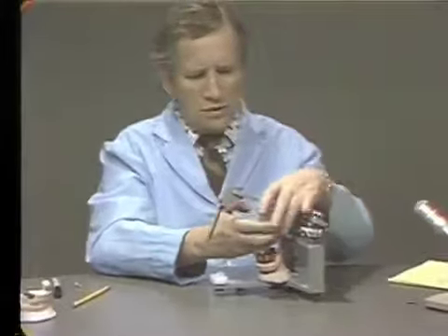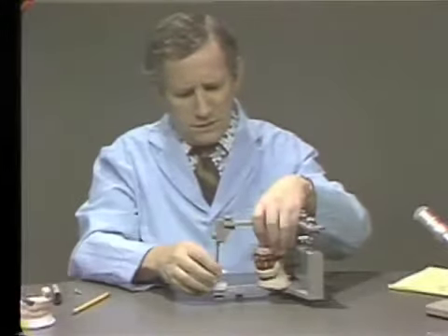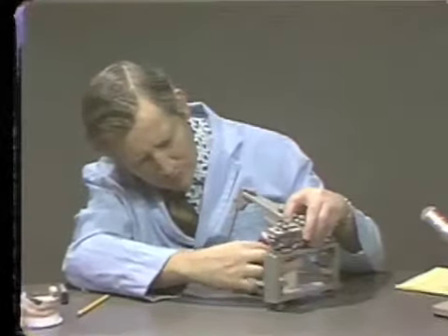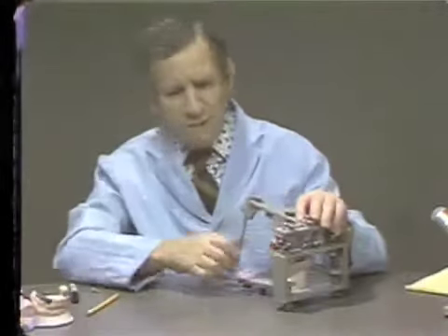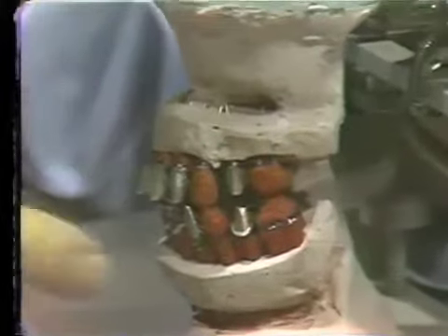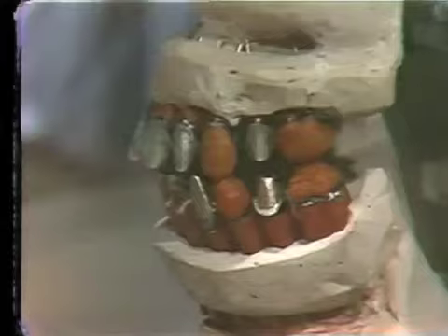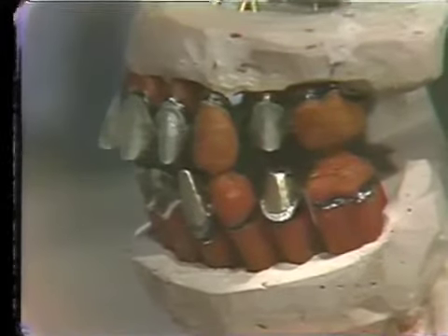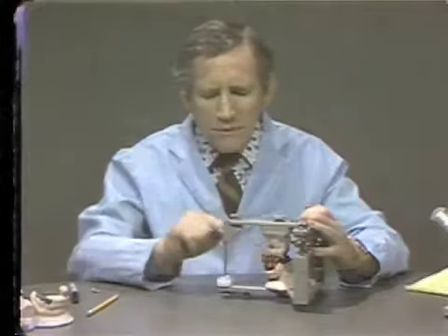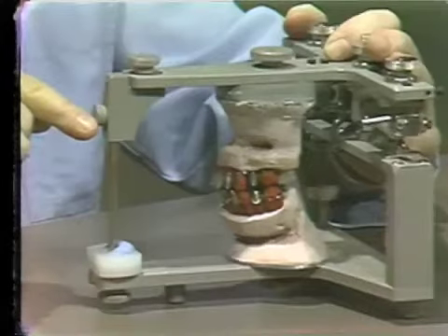If you notice on this case, we have destroyed all of the contact surfaces of the teeth, so that the vertical dimension can be changed if the laboratory technician changes the incisal pin. So what we want to do is to make sure with our bonnets in place, this is the vertical dimension that we want to maintain on the case, make sure that the incisal pin is contacting the centric stop, and this is locked tightly and also recorded so that this cannot change. If we take the bonnets out, the teeth will be separated. If this is changed, then we're going to change our vertical dimension.